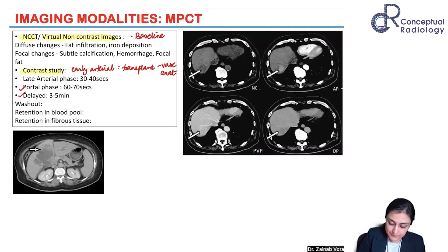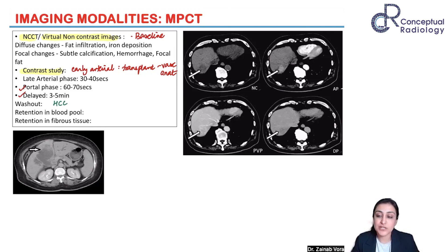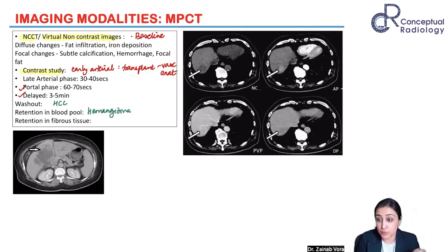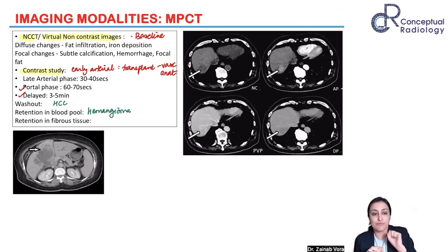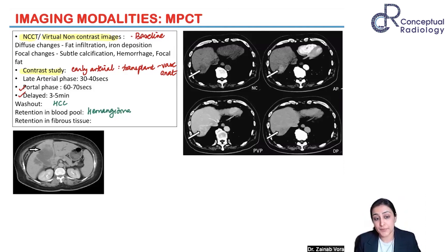In the portal venous and delayed phase, three things to look for: First, if it shows washout, we think HCC. Second, if contrast is retained equal to the blood pool, think hemangioma — remember: retention equal to blood pool. Third, if the mass retains contrast but it's in central fibrous tissue and not equal to the blood pool, think FNH — the central scar accumulates contrast in the later phase.